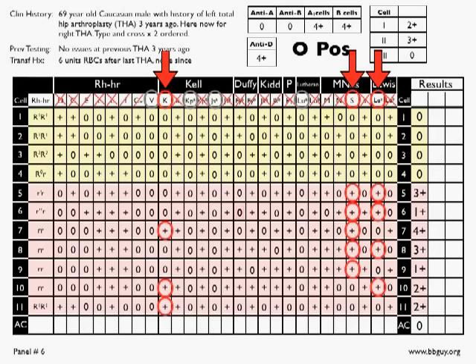So we could do some stuff. We could go down different pathways with enzymes, for example, though they may not be as beneficial because they're not hugely effective on big S, and they're not effective at all on big K. But let's not go that pathway. Let's go the pathway of trying to figure out just from the pattern what we have and see what we can do with that. So let's take a look. Okay, let's start by supposing, what if this is a combination of anti-big S and anti-Lewis a?